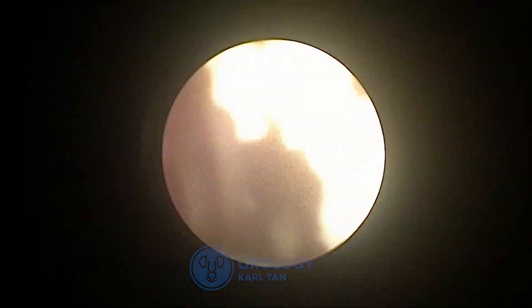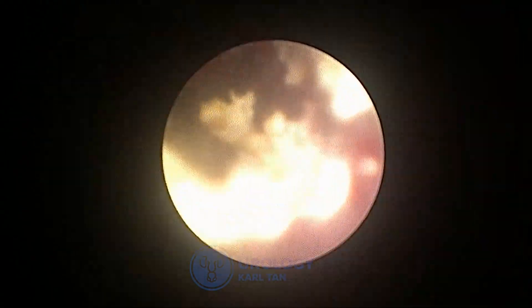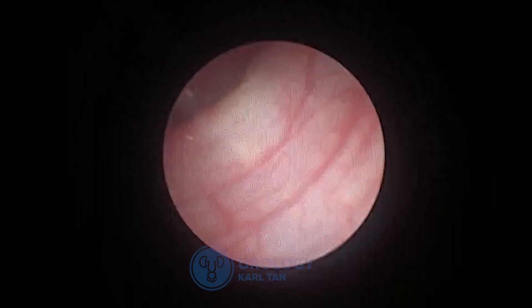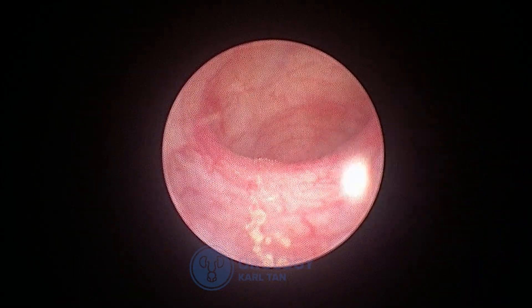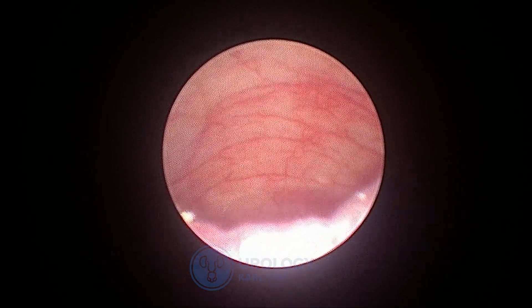As you can see now, the stones are almost entirely cleared — turned into dust, very small fragments. We are quite sure that after putting a stent or a ureteral catheter, the ureter will later be free of stones. I hope you liked this video and that I was able to share some tips and tricks using TFL for ureterolithiasis. Thank you very much for watching, have a nice day.